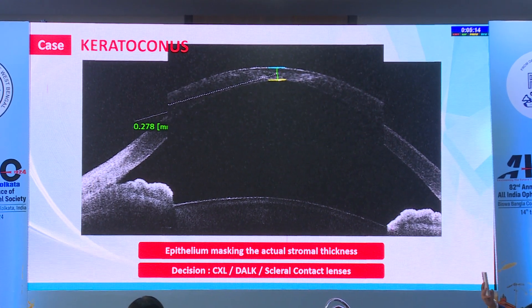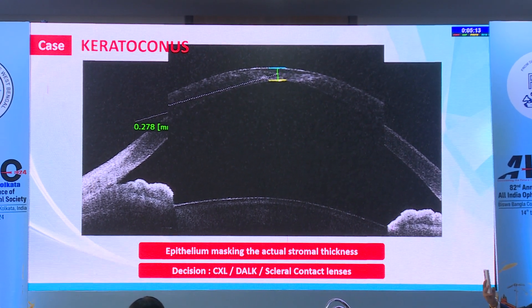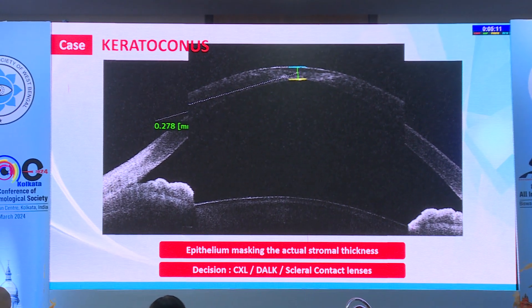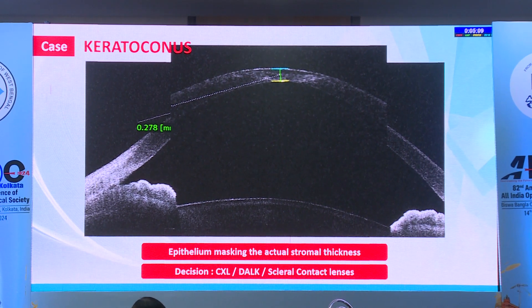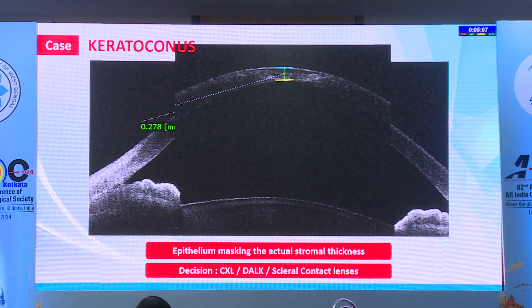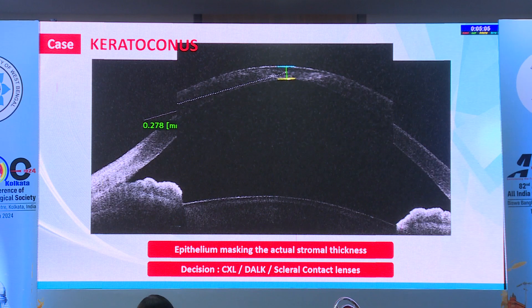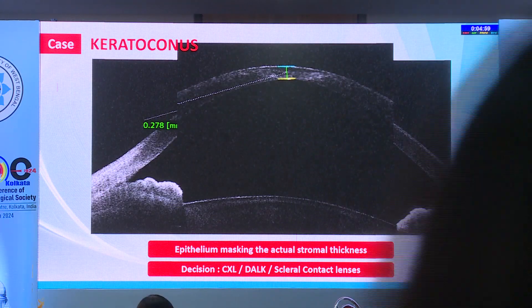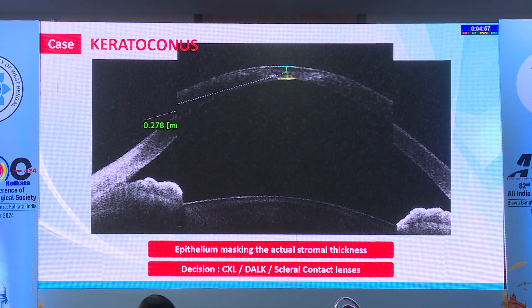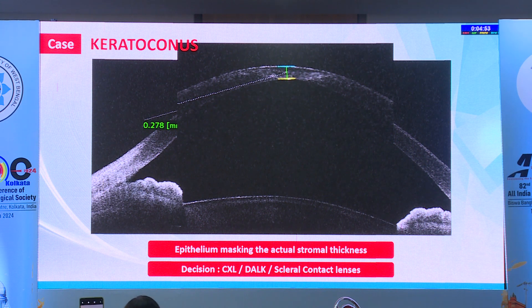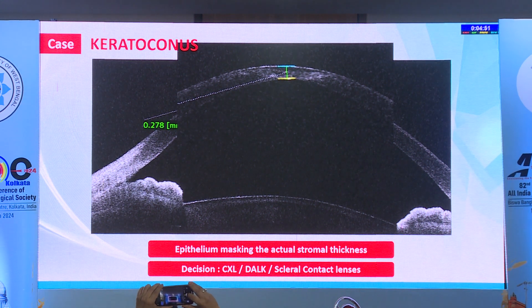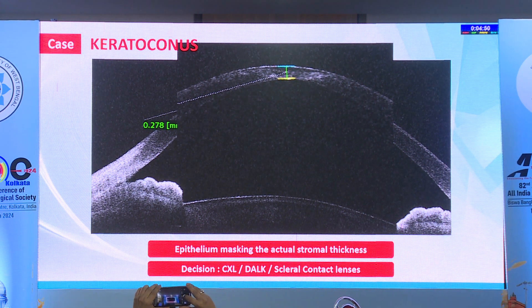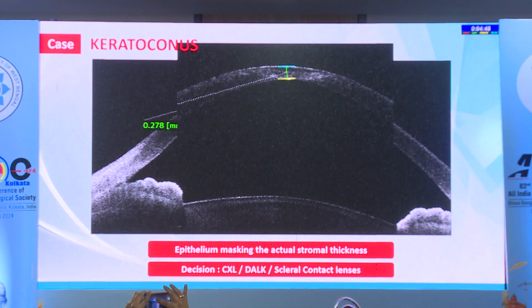This is a case of severe keratoconus, and you can see the epithelial hypertrophy in the center. On topography it gives very good thickness, but if you see on the anterior segment OCT, the stroma is actually very thin. So cross-linking won't help, and you need to decide whether this patient should be converted to a keratoplasty or continued on scleral lenses — cross-linking is definitely not the choice.